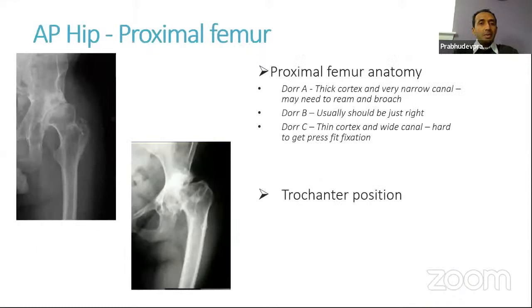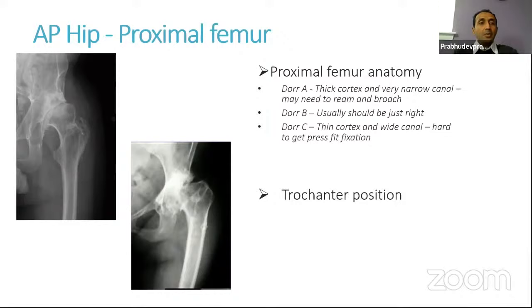The next X-ray you want to get is a good AP view of the hip joint including the proximal femur, which allows better evaluation of the proximal femur anatomy. We need to look at bone quality in the proximal femur — it has been classified by Dorr as Type A, B, and C. Type A has very thick cortex with a very narrow femoral canal. Type B has good cortices and good canal dimensions, so most stems fit well. Type C has thin cortices with a very wide canal — we may have to plan for a cemented stem in those cases.